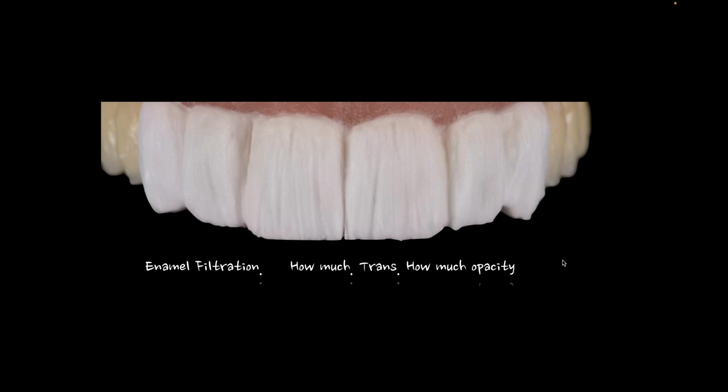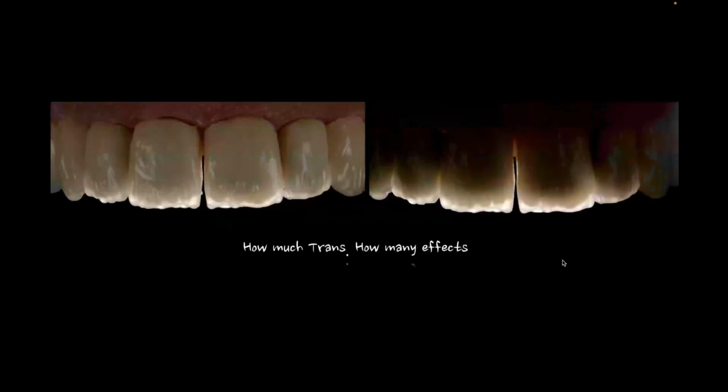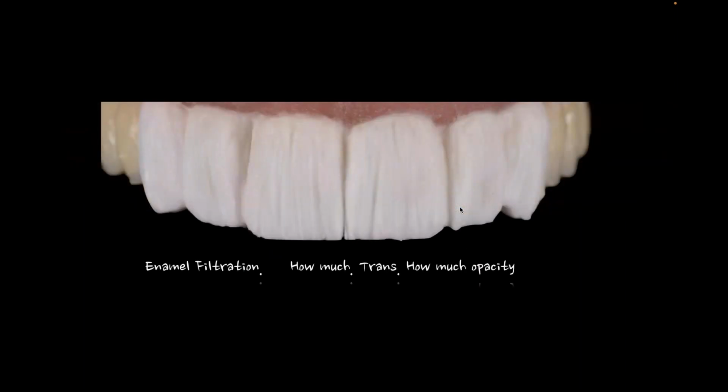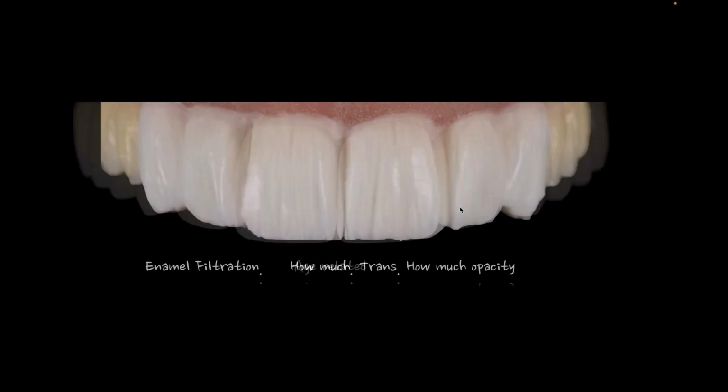Where the challenge is how much light is going to pass through the enamel and see the effects that are behind it. So remember, look at the effects that are behind this right now. I only have very little amount of translucency towards the incisal edge, but you see how with my mamelon materials, I see translucency, but not as much, right? I'm masking it. Now the goal is how much of that do I want to mask with my enamel? And in this case, I want to mask some of it. I wasn't really looking to create this heavy translucency layer.